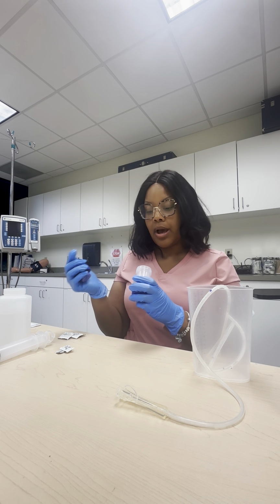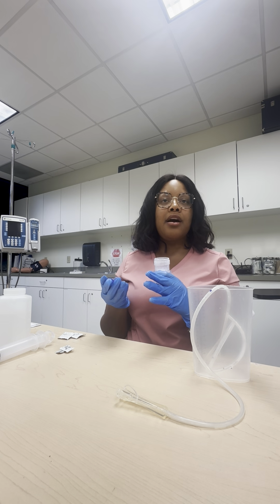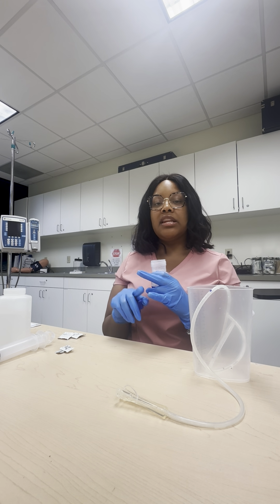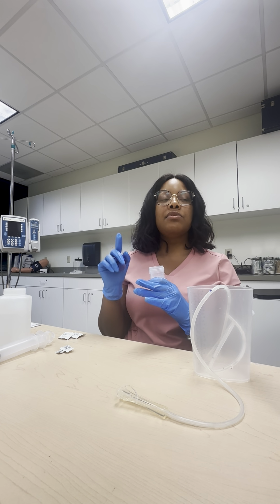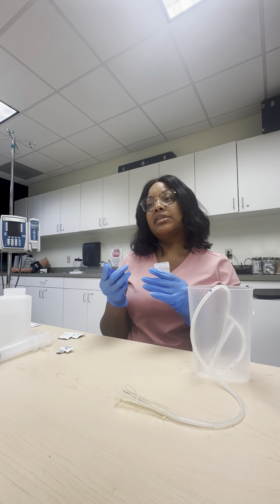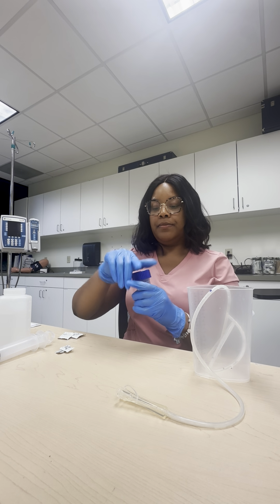All right, so I'm going to go ahead and crush this medication. Now, what is our thinking when it comes to crushed medication? We can't crush extended release. We can't crush delayed release. We can't crush control release. We can't crush enteric coated type medications. So that medication was none of those. So we're good to crush.